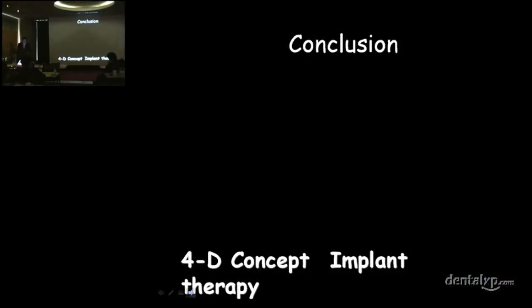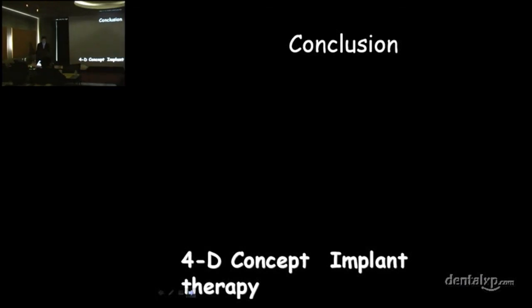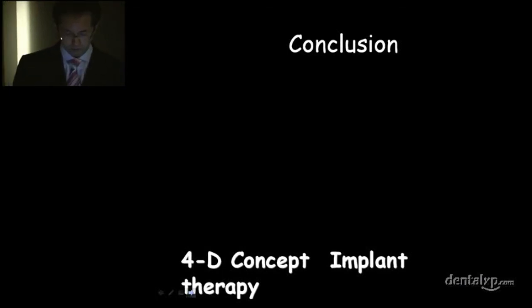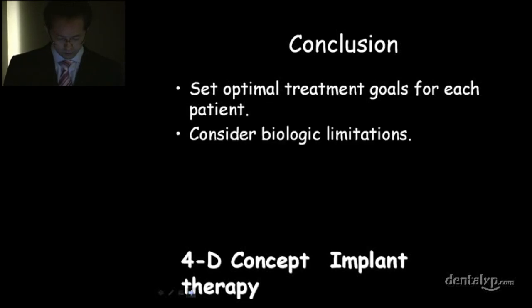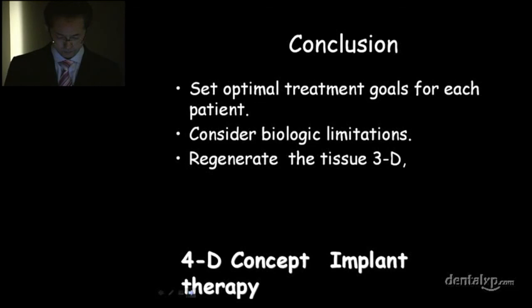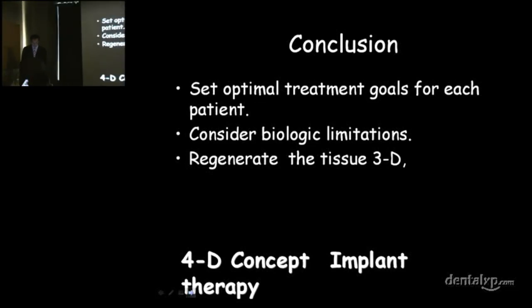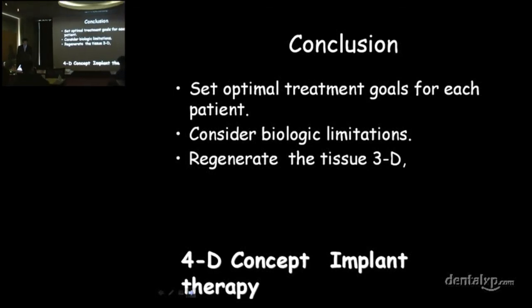In conclusion, to manage multiple implant cases, specific treatment goals should be set. Consider the biologic limitation and take countermeasures. Preserve and three-dimensionally regenerate tissue as much as possible.